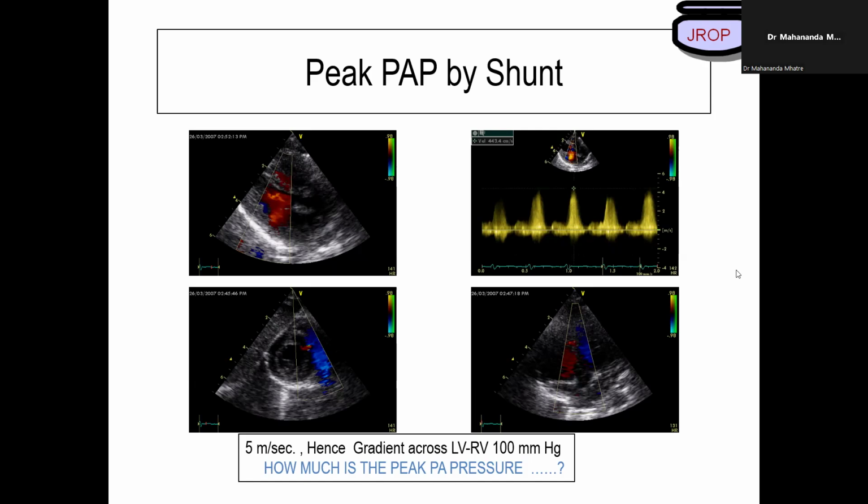More than 25 is abnormal, and we happen to find values between 21 to 24. We consider that a watchful pressure in case a patient has a history of hereditary pulmonary artery hypertension or some other cause, idiopathic. The question is not whether mean pulmonary artery pressure is 25. The day it crosses 25, it's already elevated. So the normal mean is 20 millimeters.